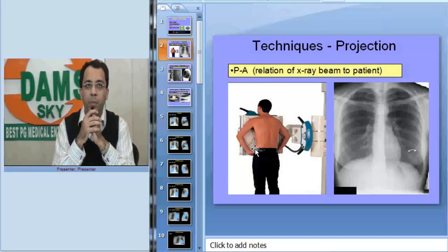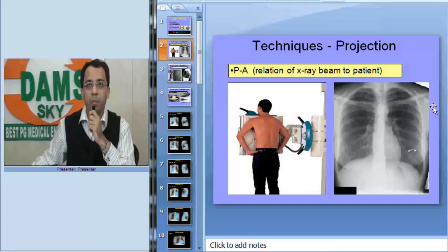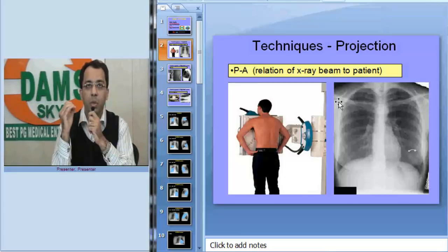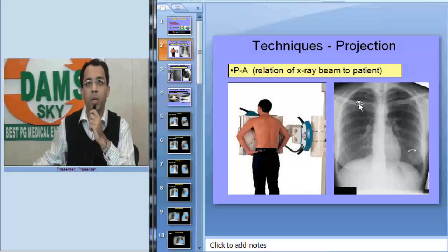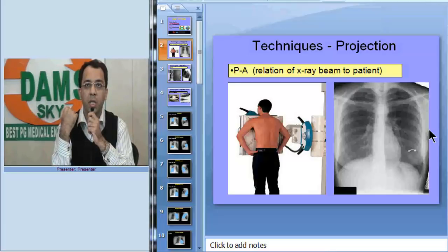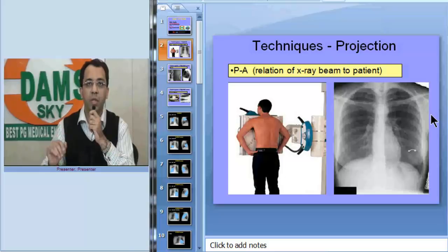A very common question physicians ask is how do we differentiate between a PA view and an AP view? Look at the scapula always. In a PA view, because the patient is standing erect, we can ask him to rotate his shoulders forward, so the scapula is removed from the lung field. In an AP film, the patient is lying down, so the scapula overlies the lung fields.